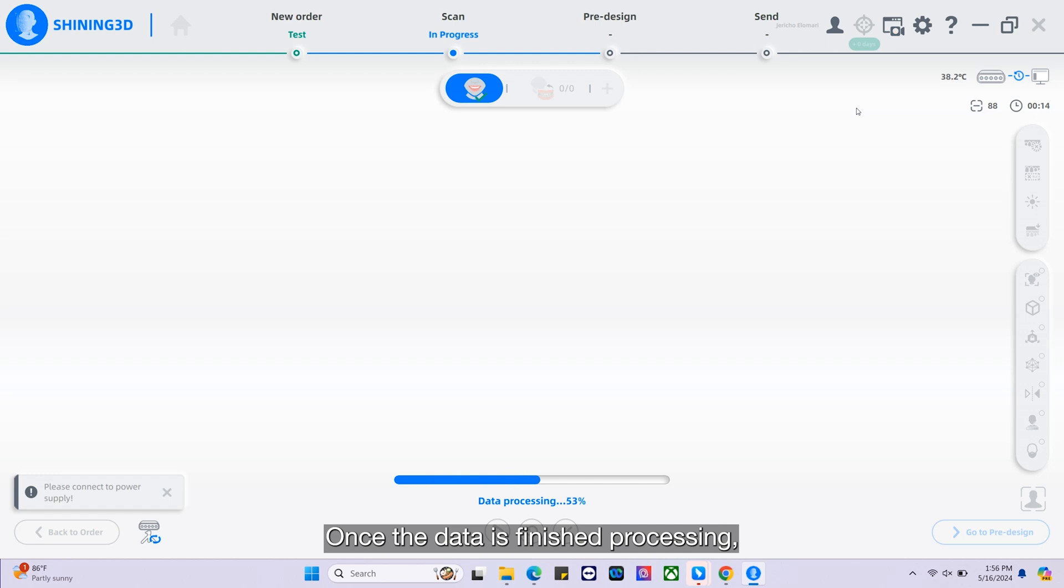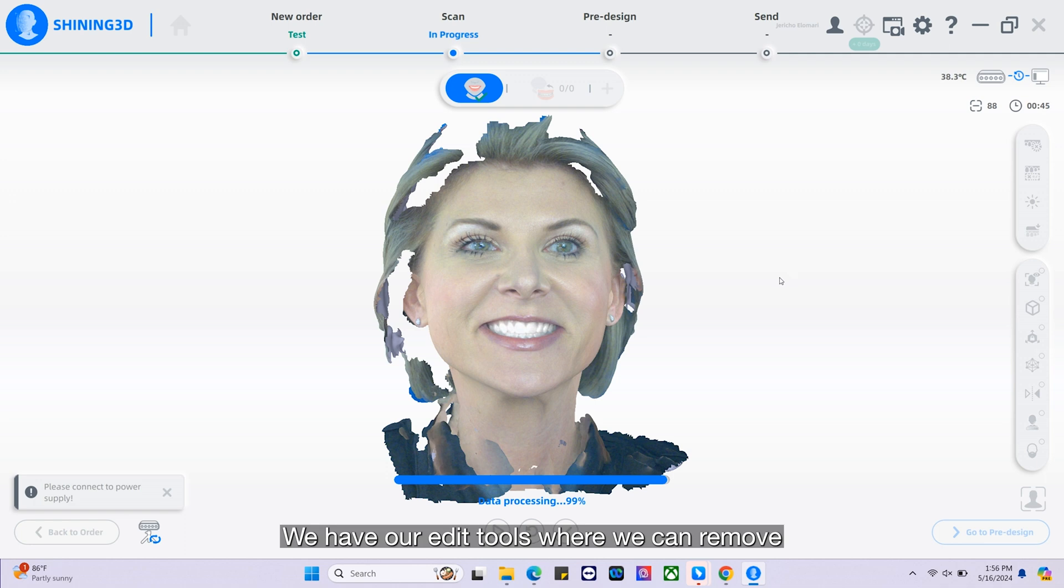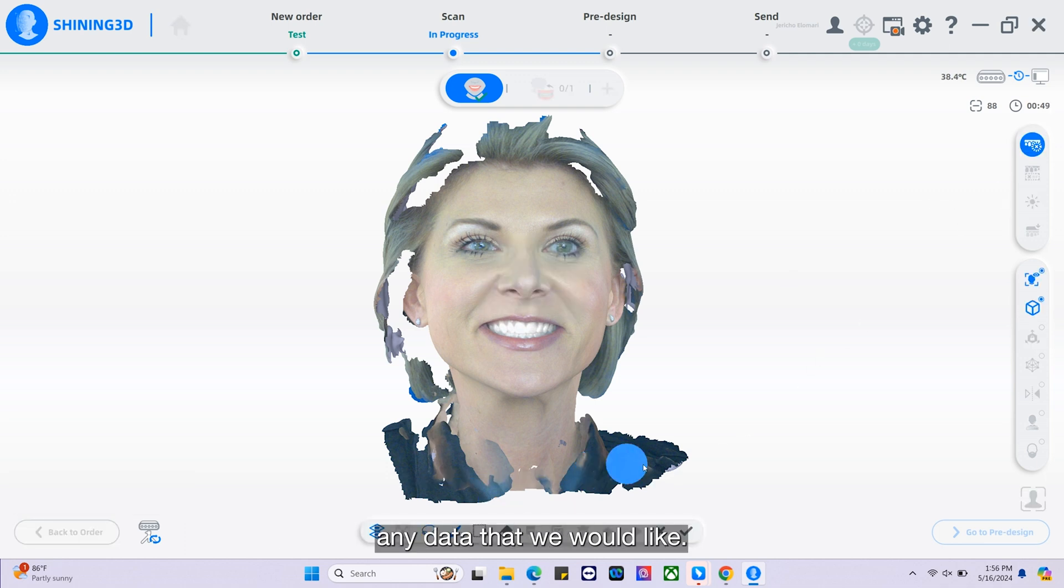Once the data is finished processing, we do have some functions to the right of the screen. We have our edit tools where we can remove any data that we would like.